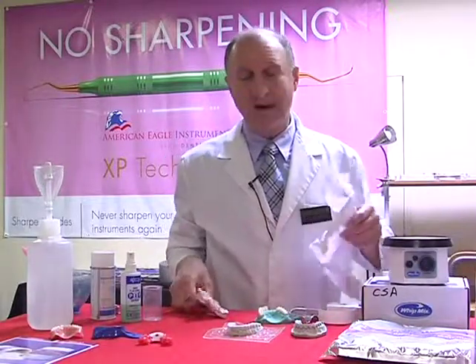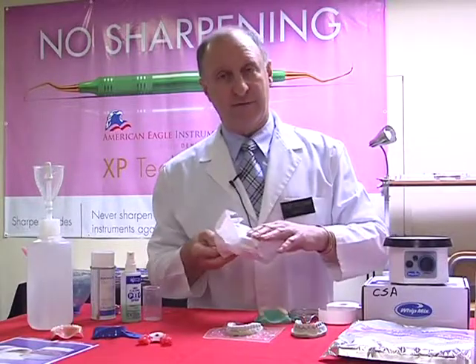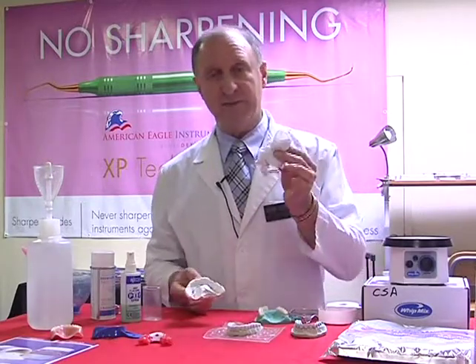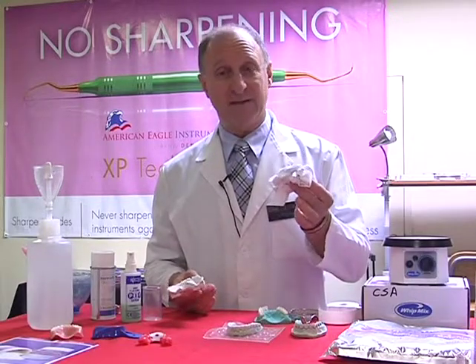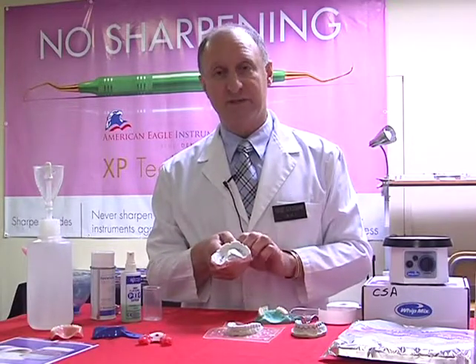They then normally wrap them around the impression and wet them and then bag them. Five years ago, that was the case. We could do that safely, but not anymore. Things have changed because the paper we're using nowadays is recycled. When it gets wet, it's made to break down, and then fibers will actually depart from the surface and impart into the alginate impression surface.